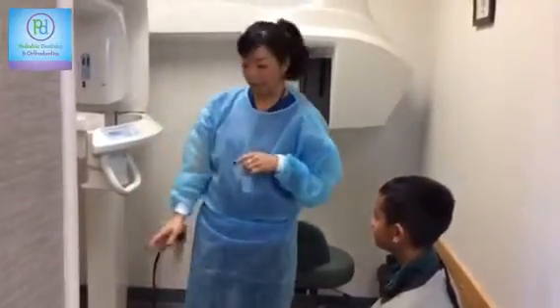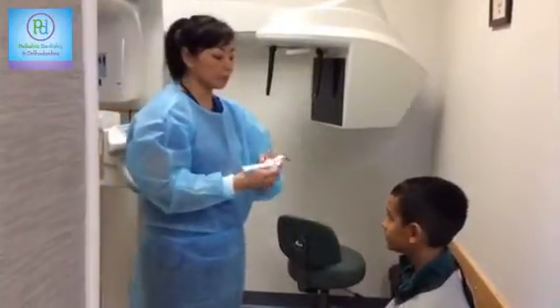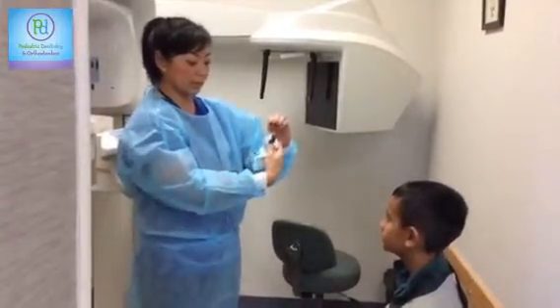Let me get the machine set up. This is called a bite block. What you're going to do, you're going to bite your top teeth into here, your bottom teeth into there, so it's going to look like this from the side.